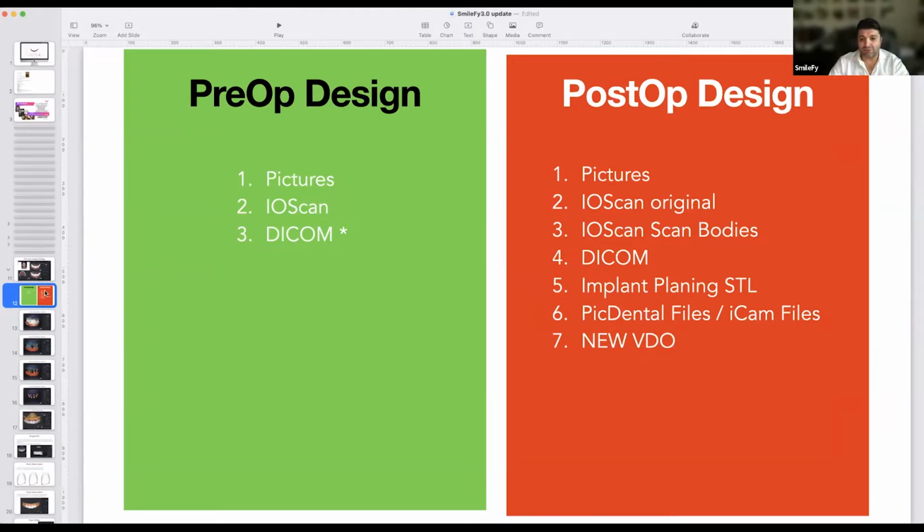No matter what the situation of the patient is, in the first step, we start with the face. We want the patient to look good, in harmony not only with his face, but also with his personality. We design the smile first, and afterwards we reverse engineer the smile to the treatment plan, and then we see what needs to be done to make the smile a reality.